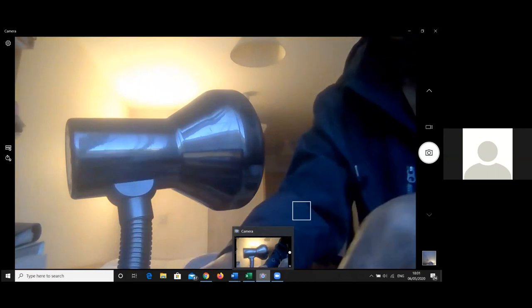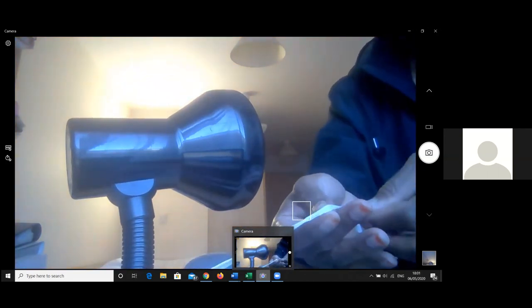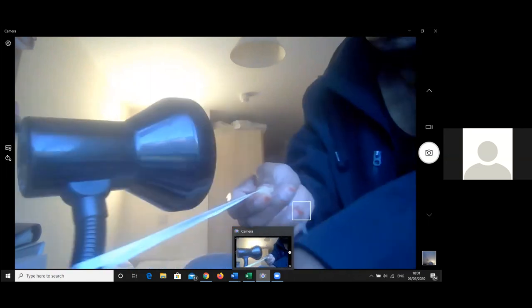So that was extracorporeal knot tying, or making a Roeder knot. If you don't have an assistant, you can just use a teacup or a hook, a door handle, or just the arm of a table or a chair. Does anybody want to try doing it live just now online? So it's as if you've gone around a cystic duct. Yeah, I'm around the cystic duct now. Okay.